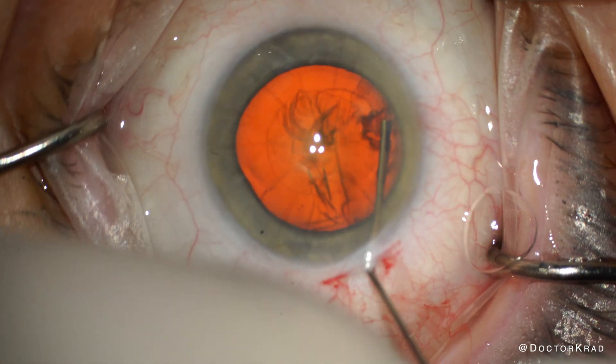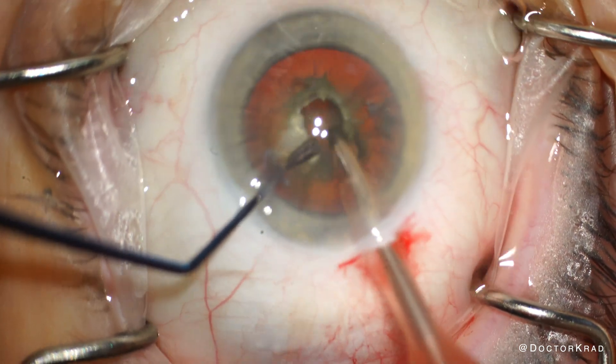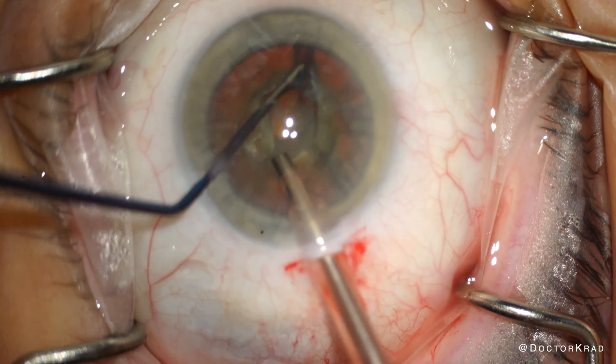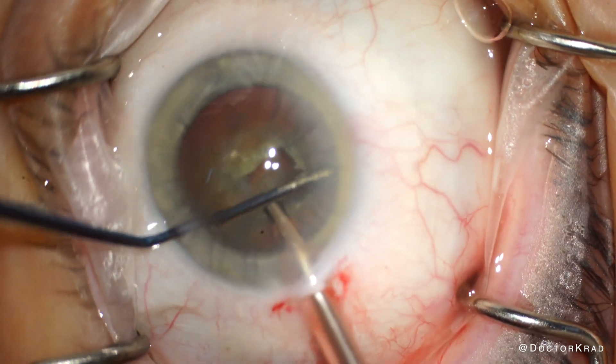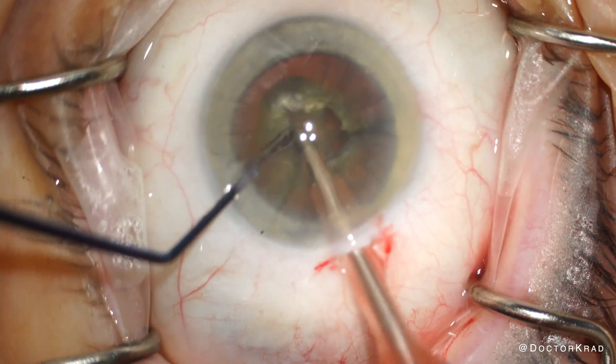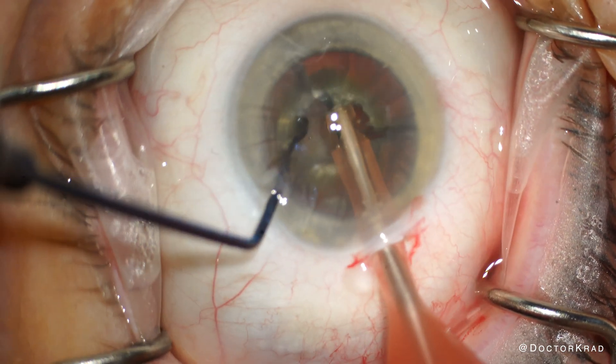We just finished the capsulorhexis, and now we're going to hydrodissect and then start taking out the cataract. The case is very routine so far, and I don't see any chemosis by the main incision. Whether you chop or divide and conquer, use whatever technique you're most comfortable with and whatever is most appropriate for the cataract.